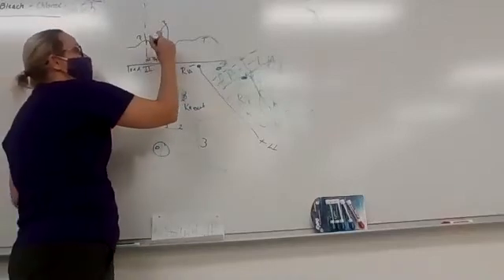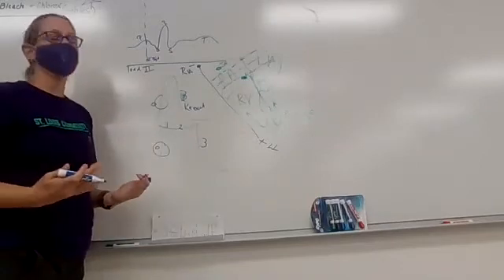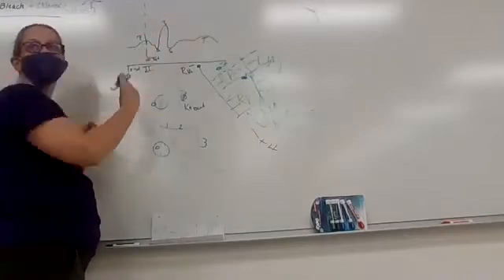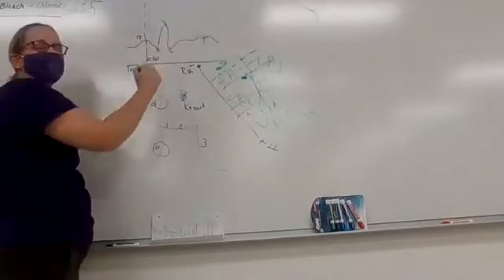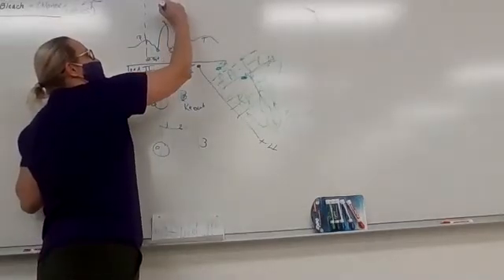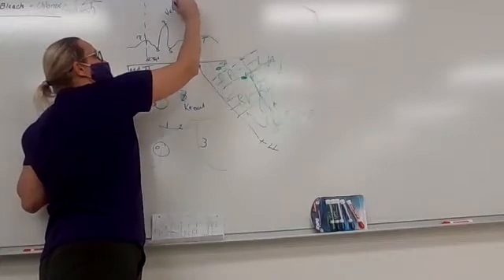But very quickly, we start to see another rapid rise in depolarization of cells. And we see them happening in more cells and more quickly. So we see that this QRS complex is occurring. And the QRS complex is when we know that our ventricular cells are starting to depolarize.